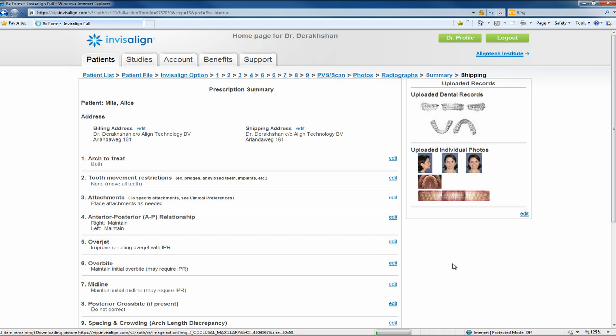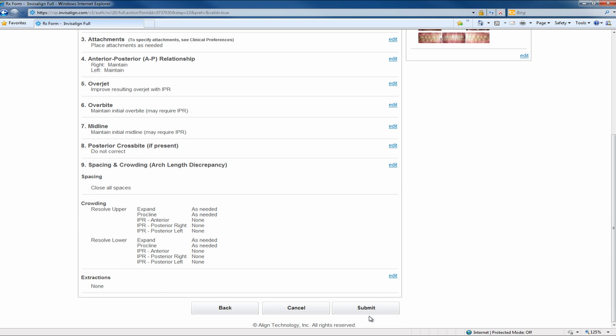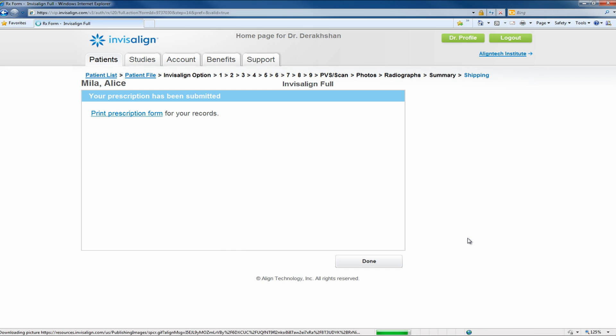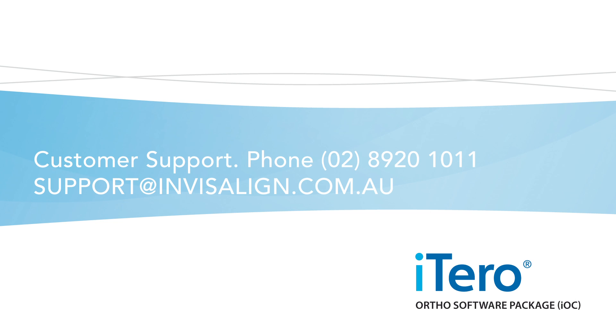A summary is presented at the end. If the scan was uploaded successfully, it will be displayed in the upper right side of the page. Submit the prescription if all details entered are satisfactory. Agree to the terms and conditions to finalise the submission process. Once done, the prescription will be listed in your patient's file and the scan will be included in it. This concludes the iTero ortho software training video. If you have any questions, feel free to contact us.